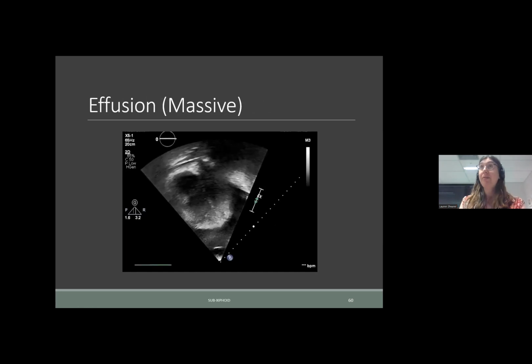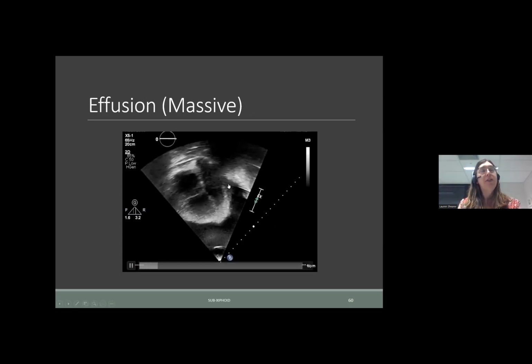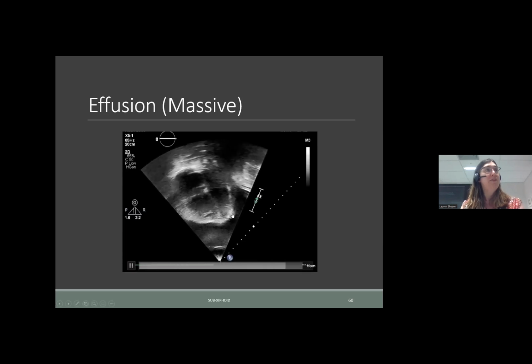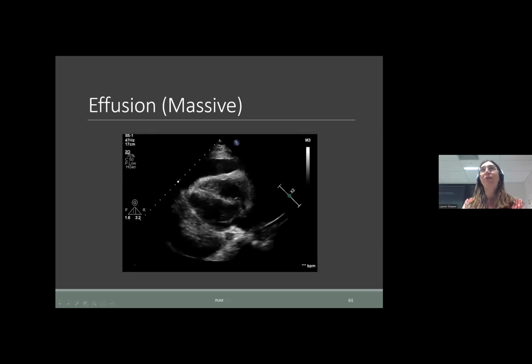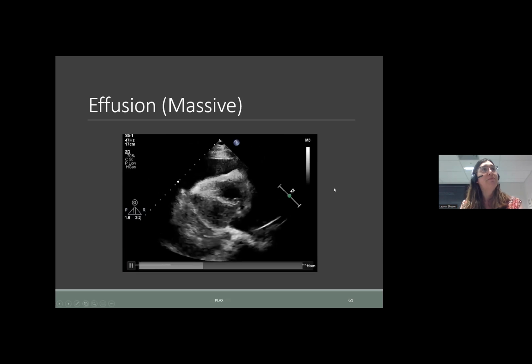Pericardial effusions, with tamponade being the extreme clinical presentation where it's affecting the hemodynamics, are important. And this is a massive pericardial effusion. Usually the pericardial space has just a few mils of fluid in it, which acts as a lubricant and cushion. This child's heart from the subxiphoid view sits here, and it's sitting in a bucket of basically water. As we look through some of the other views in the long axis, it's very hard to get good views here, but we see a large amount of fluid around the heart.